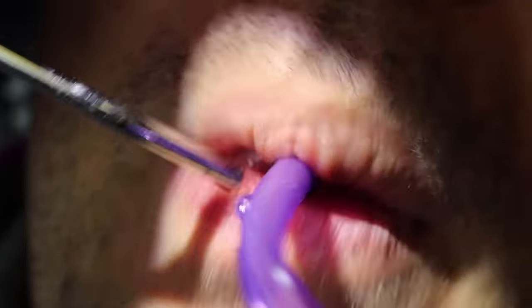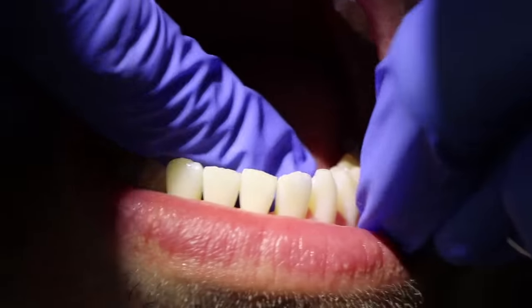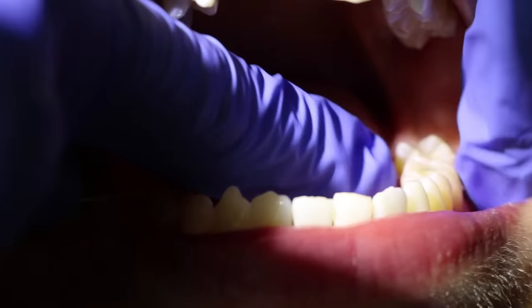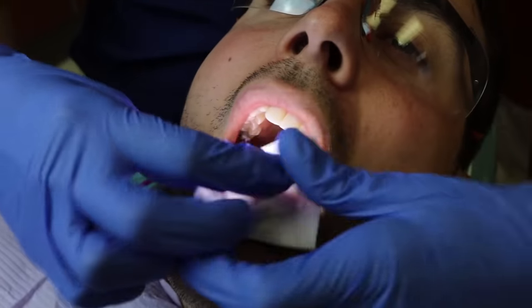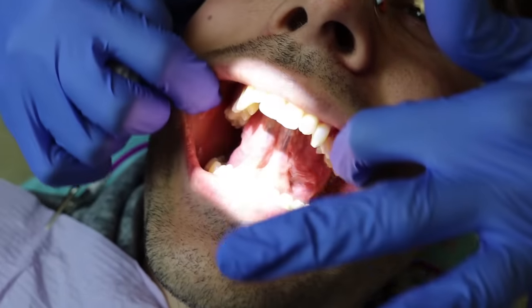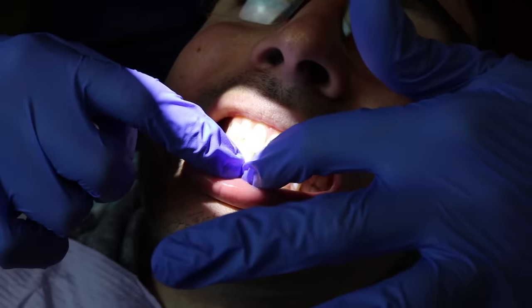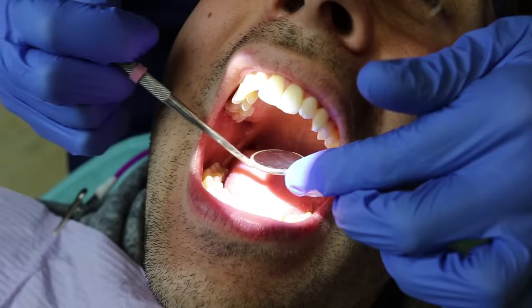Wrapping up here at the end — we generally floss, making sure all that crunchy stuff is out from between your teeth. It also helps us feel the contacts; we're doing a little exam while we're flossing too. Then at the end, we'll do an oral cancer screening where we check the sides of your tongue and underneath your tongue to confirm there are no suspicious lumps or bumps present. After the hygienist cleans your teeth and does an exam, the dentist will come in and do an exam as well.